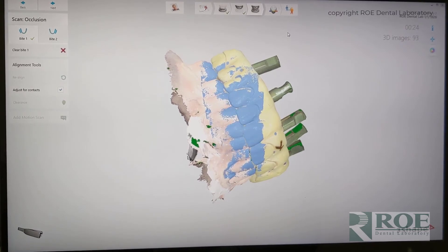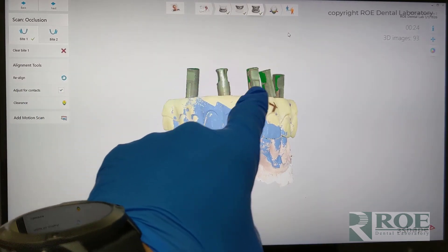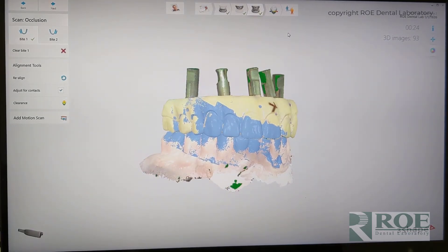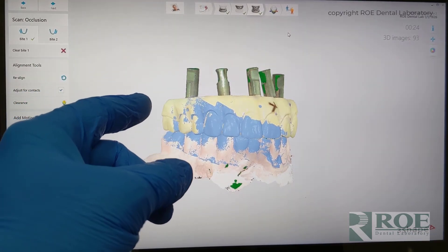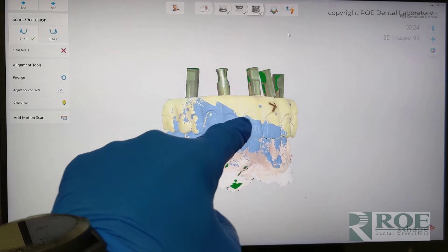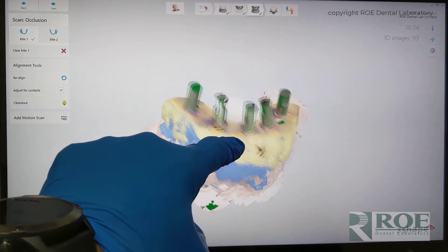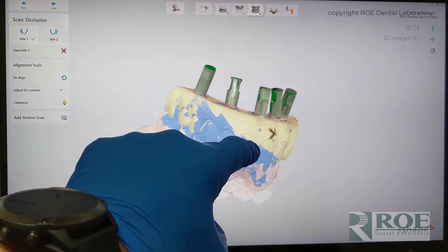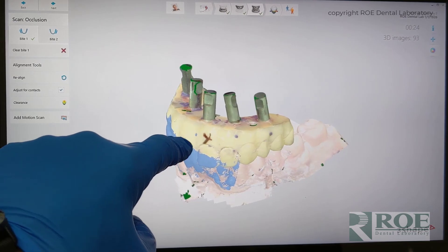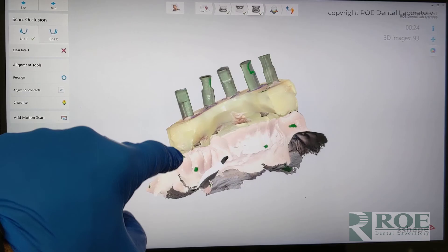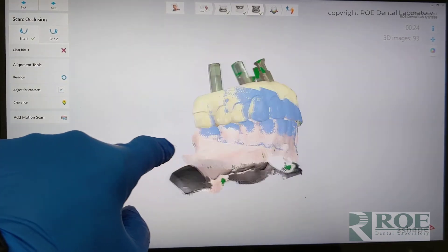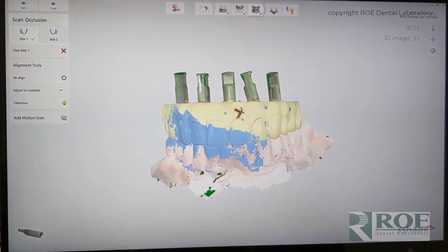And that is an iJIG scan. Simply send this to the laboratory and tell us what implants these are — that is very important. These particular iJIG analogs are Nobel compatible, but we work with most systems. We have libraries for most of the systems, but not all. We want to know what implant system this is. If it's a third-party implant, we want to know that too, as it may require special analogs. So be very specific on the implants. If you have, for example, a Straumann, a Nobel, and a Zimmer in the mouth, please let us know which one is which — very critical for us to do our job. Send this off and then we will fabricate an iJIG for you to try in the mouth, sectioned and picked up together.